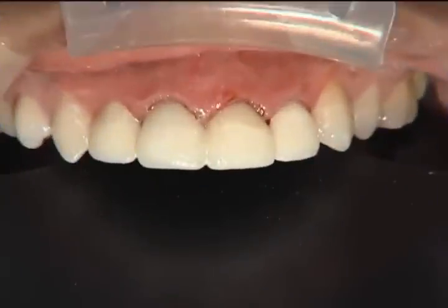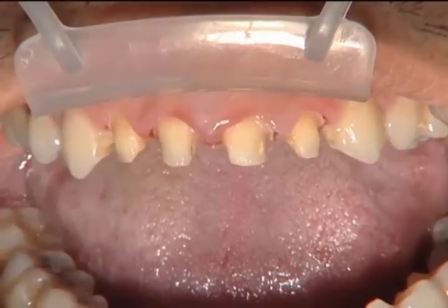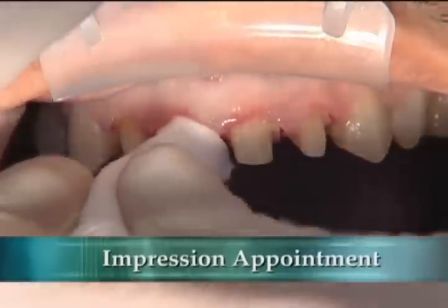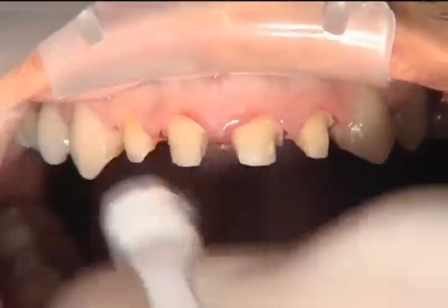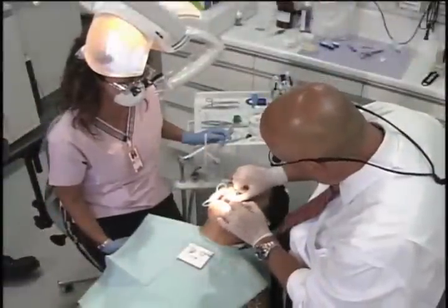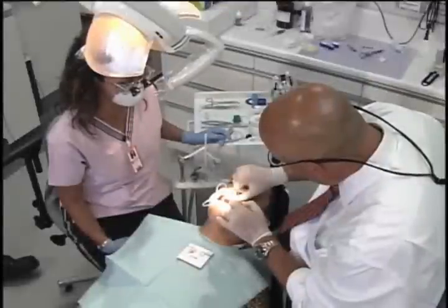Once we've done that, we'll take it off, trim around the margins, and cement those four units into place, because the rest of the units are going to be no-prep veneers. For the no-prep teeth, we don't have to worry about preparation at all — we just need to make sure the teeth are clean and get a good impression. Remember to syringe around the gingival margins of those teeth so the impression material gets down along the sulcus.